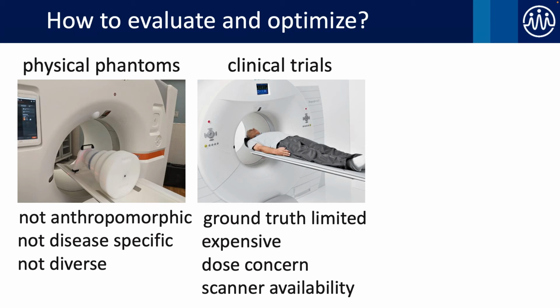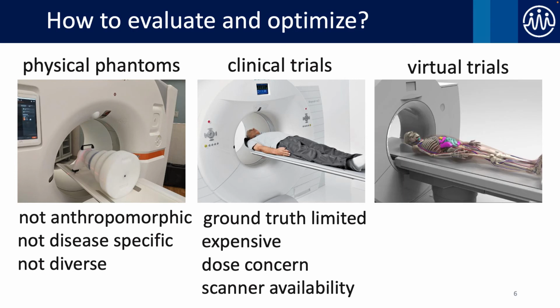There's a dose concern. If you want to image and optimize a patient across various scanners or multiple settings, you need to overdose the patient, and this is something that we don't want to do. So that's also ethically infeasible. And scanner availability is another issue for these new technologies, and not every hospital has access to that. So we cannot do those studies as well.